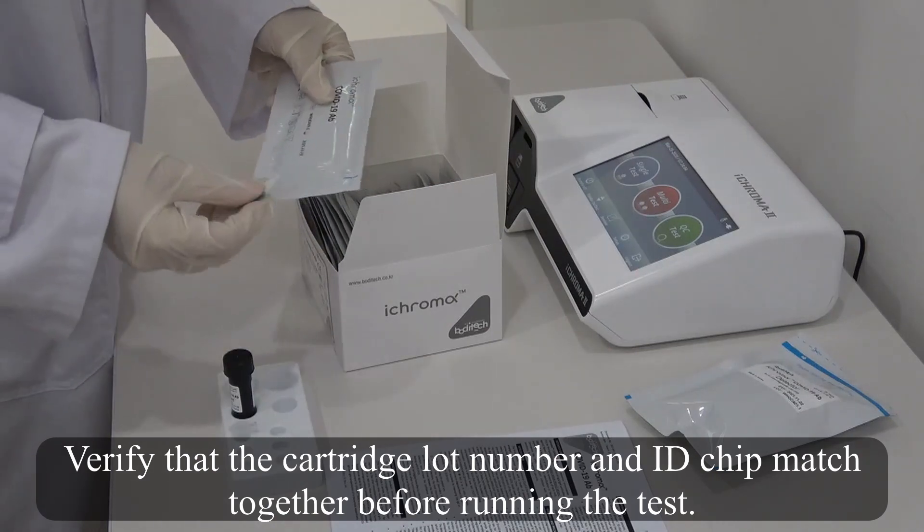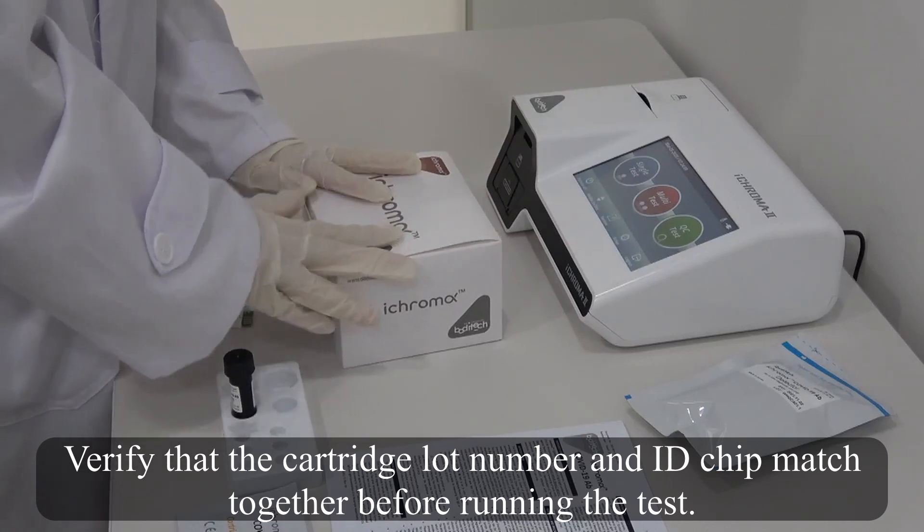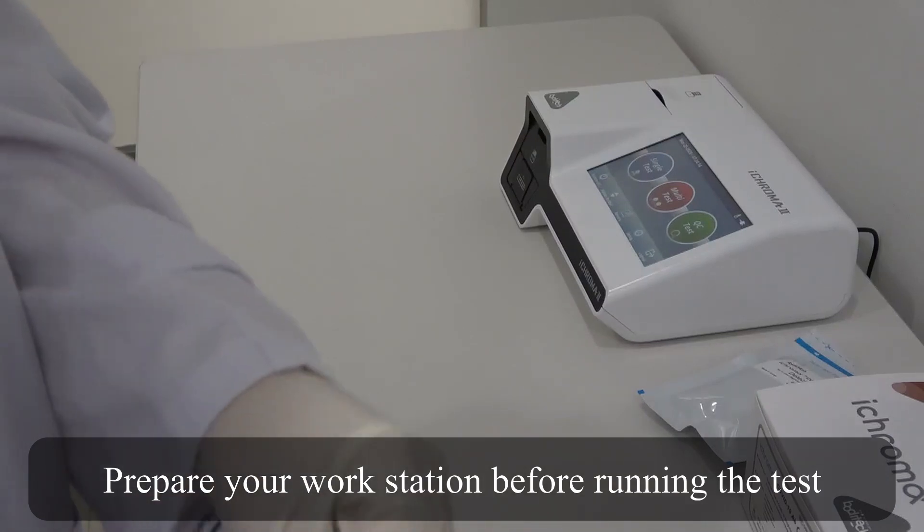Verify that the cartridge lot number and ID chip match together before running the test. Prepare your workstation before running the test.